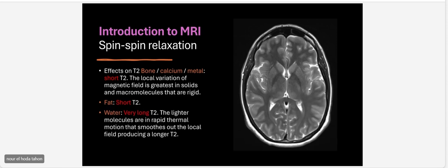Okay. And this is also an MRI brain image, the T2 axial cuts. Now you can imagine how it looks different between the T1 images that I showed you and the T2. Just to make it interactive, can someone tell me what difference you notice between the other images and these images? Regarding the components of the image, anything. For example, the white matter.